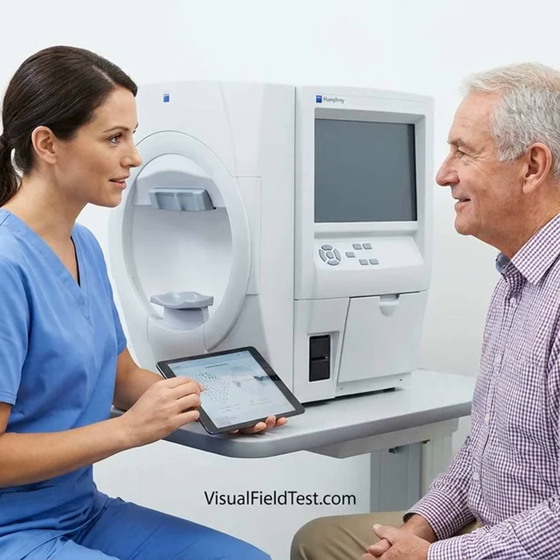Pre-test preparation checklist. In-clinic visual field test. Before the appointment, get adequate sleep and schedule the test when you are usually most alert. Avoid alcohol before testing. Tell the clinic about antihistamines, sedatives, sleep medicines, or other medicines that may make you drowsy. Do not stop prescribed medicines unless your clinician specifically tells you to. Bring your usual glasses or contact lens information. Tell the technician if you have neck pain, tremor, arthritis, hearing difficulty, drooping eyelids, or difficulty keeping one eye covered.